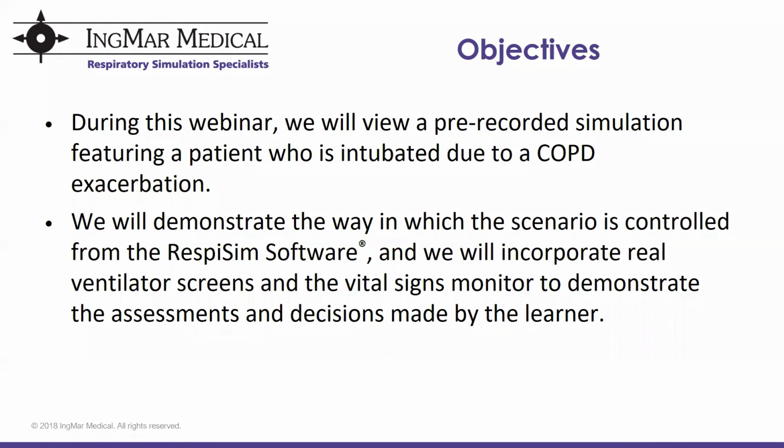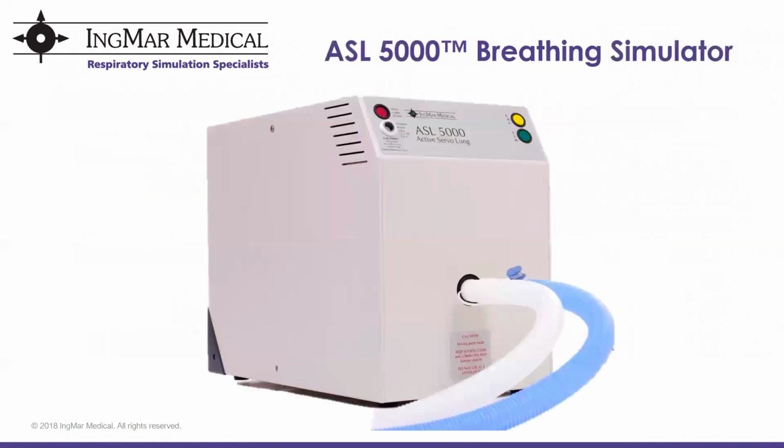But one of the main purposes of today's session is to demonstrate the way in which we control these scenarios using the RespiSim software. So for that reason, and I hope this isn't too redundant for those of you who are already familiar with Ingmar, I'd like to start by providing a quick overview of the approach we take to creating simulations with the RespiSim system.